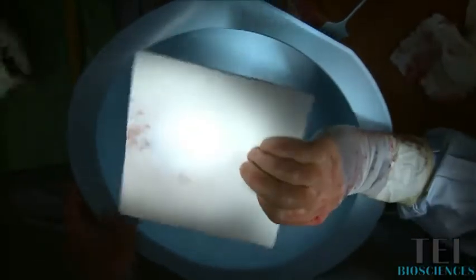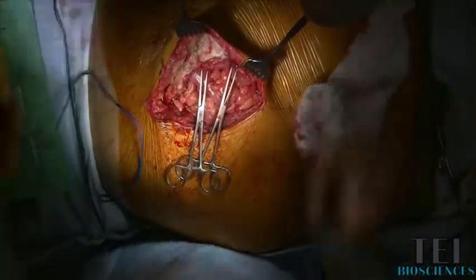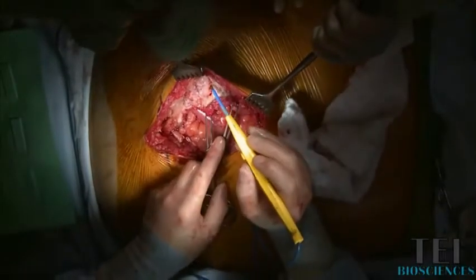This is the Sergium End, a 3 millimeter thick 16 by 20 piece. You can see that it's pretty stiff when it comes out, kind of like rawhide. We're going to put it in room temperature normal saline, and you'll see what happens to it over the next five minutes. Unlike some of the other dermal matrices, it rehydrates in just a couple of minutes.